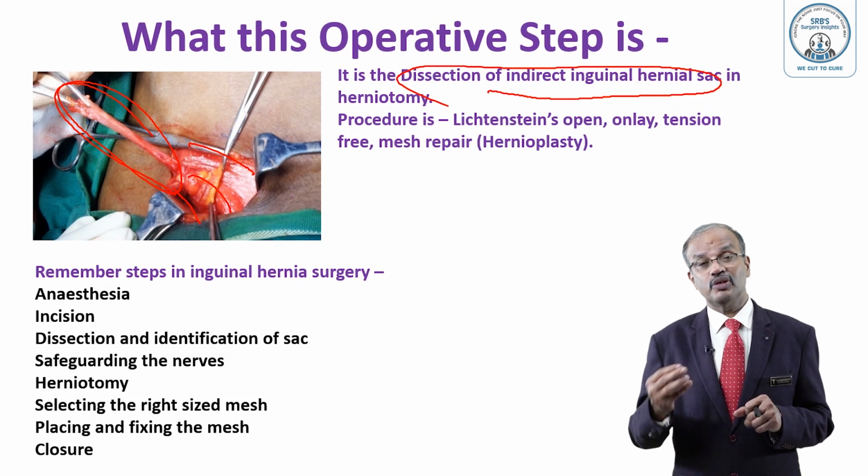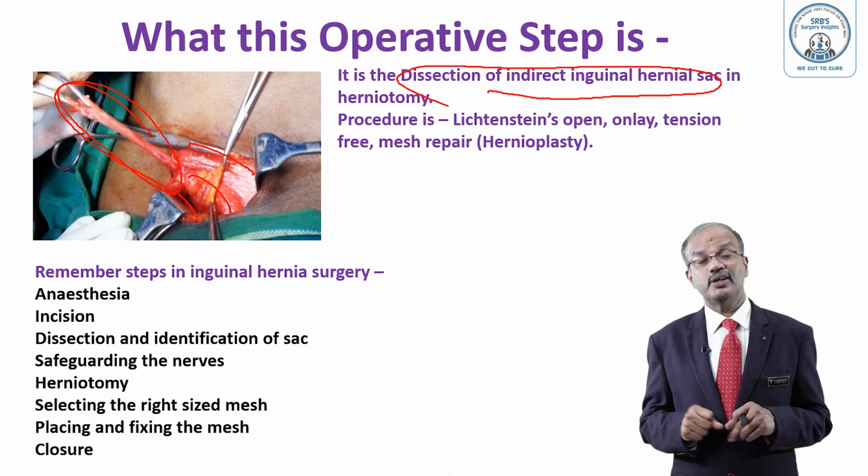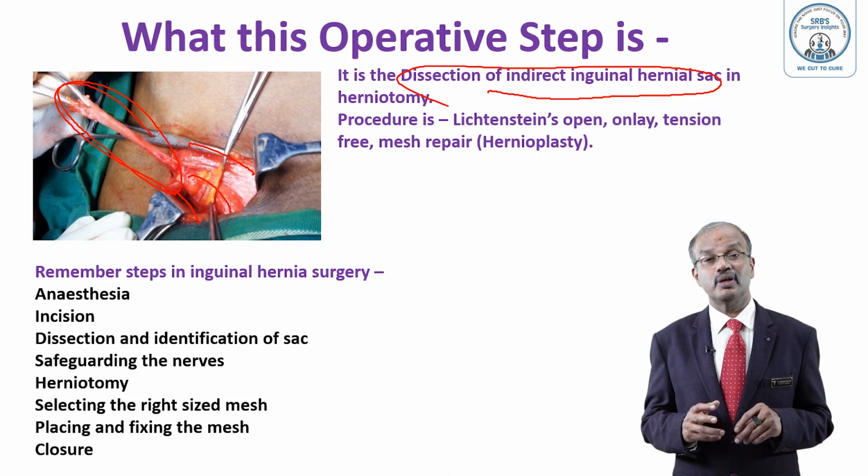Why you are twisting is because the content should not come through while you are transfixing. You may take the bite from the bowel. Then transfix and ligate it with Vicryl, polyglactin, number 2-0 or 1-0, and the distal part you remove. It is called herniotomy.